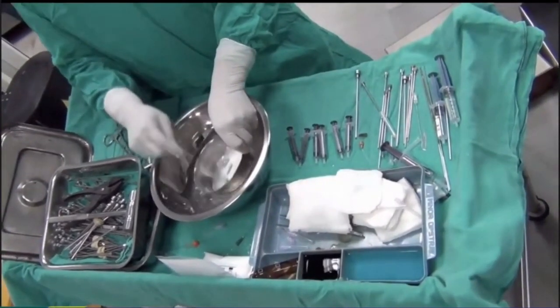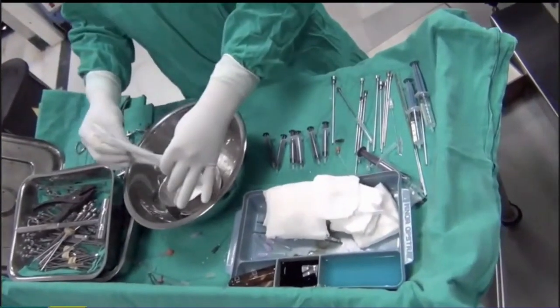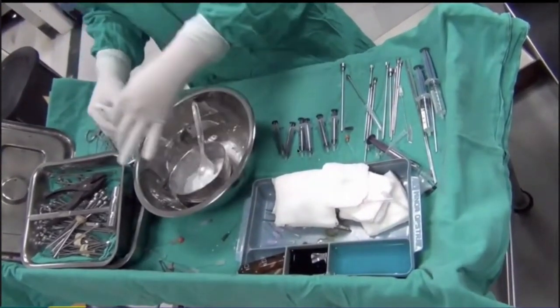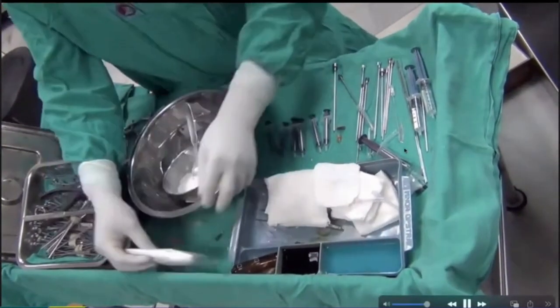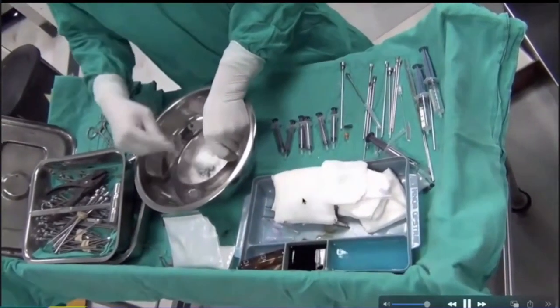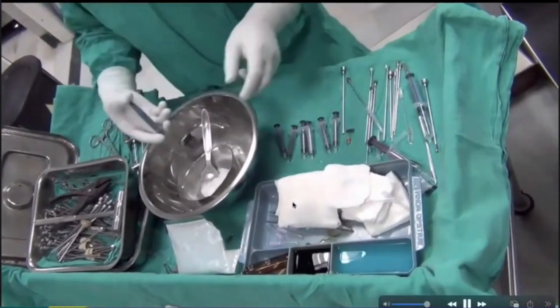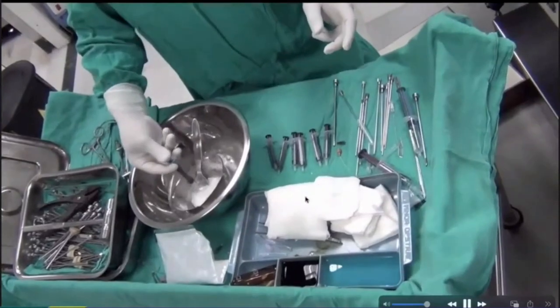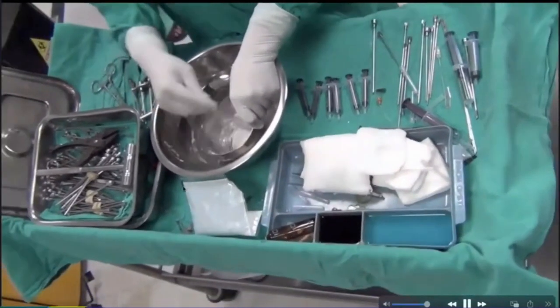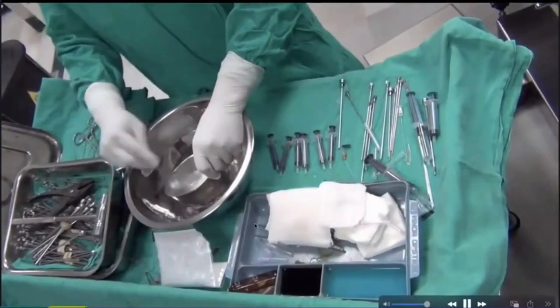I put in a dye, I told you. I put in antibiotics also in the same cement. And I'm just trying to get the right consistency before I start injecting. So this is very, very important. Different syringes, different trocars, needles, everything has to be kept in mind. And I keep some pads here because when I have to push the pusher into the needle, when the cement is hardening, at that time these gauze pads are very, very helpful. A plier and hammer is always of big help, because sometimes your needle gets stuck. This is the antibiotic I'm adding to the cement here.